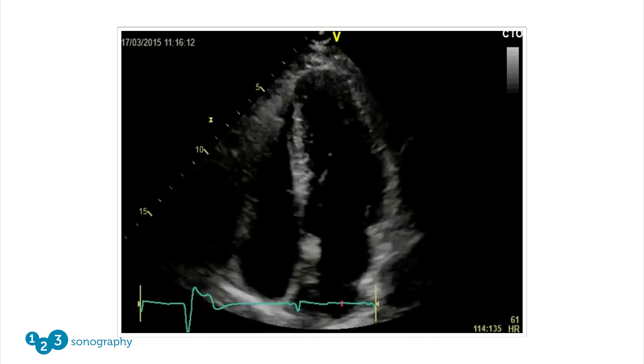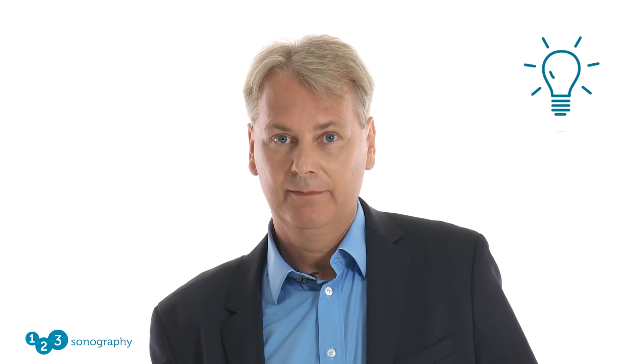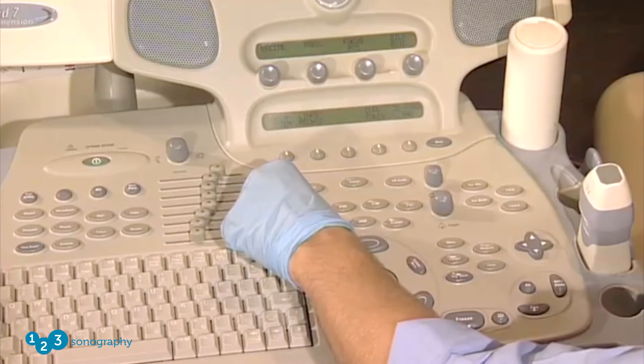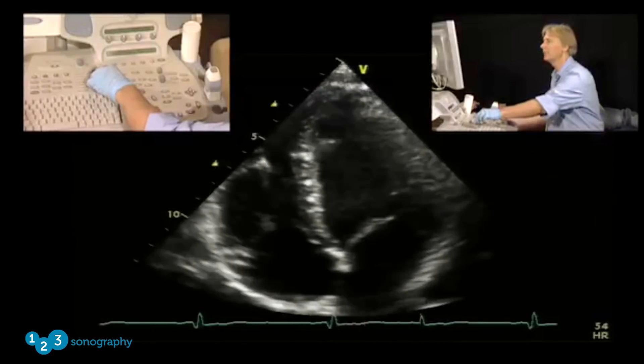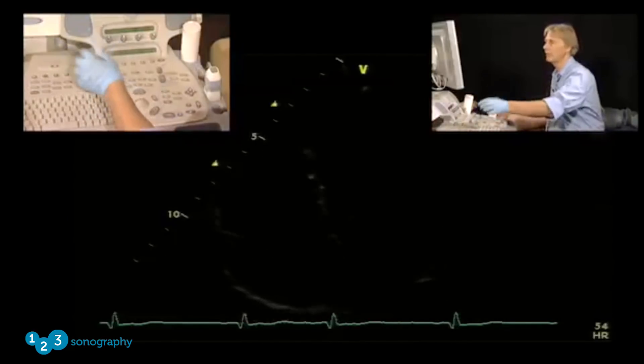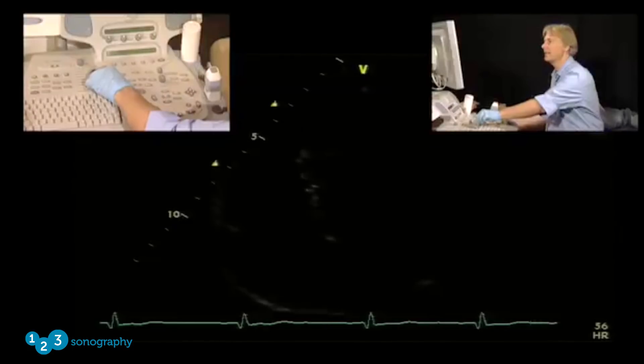Let's take a look at the echo image that Scott is acquiring — a four-chamber view. Can you make the diagnosis from this four-chamber view? The image is just too dark. You need to improve the gain, and I'll show you why. Every machine has a gain button, and gain is usually not increased appropriately. If you do not increase the gain, you will get an image that is simply too dark. You might have the blood pool dark, but you can't see the endocardial contour. You have to use a mid-range setting so that you see what you're supposed to see.